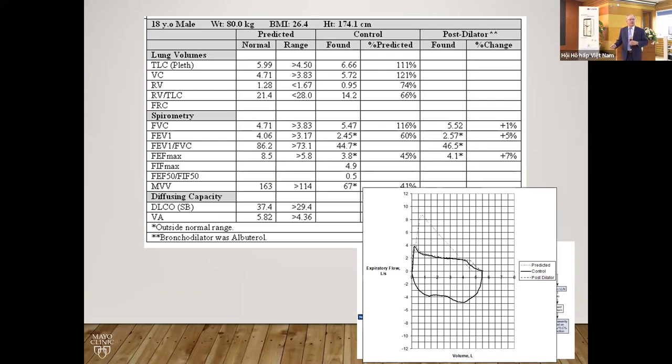Typically, it's very common, or should be common, that the peak flow expiratory is equal to the peak flow inspiratory. Sometimes maybe a liter less, but the size of the tube is the size of the tube.